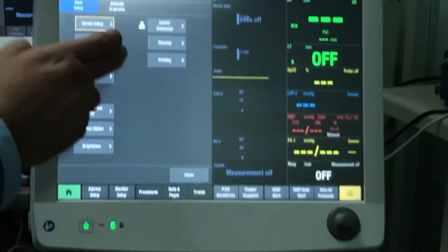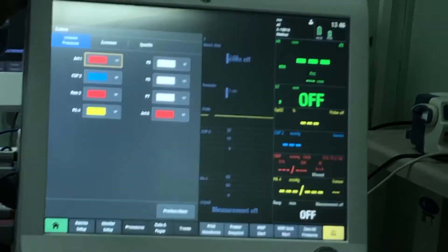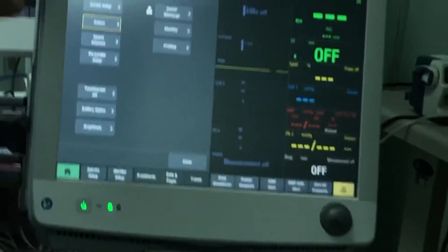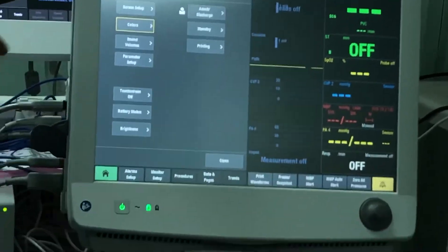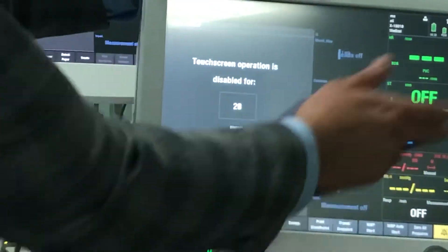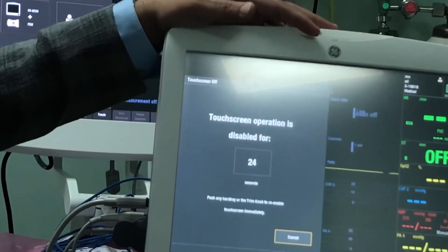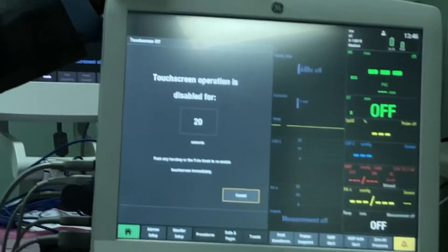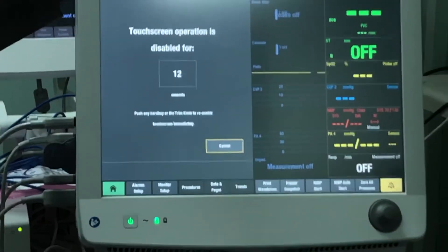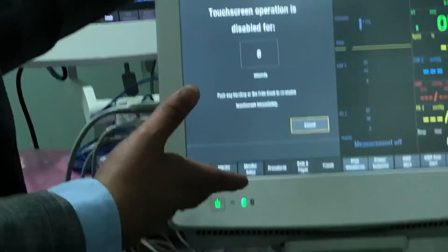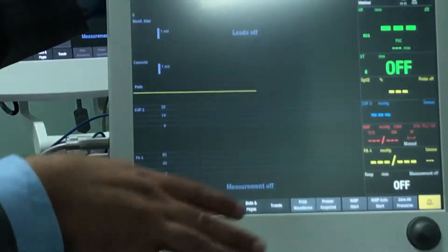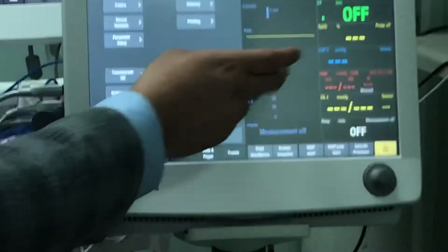You can change the colors for parameters — make SPO2 pink if you want. Just make sure if you change colors you notify others in the same department, otherwise nurses and doctors will get confused if SPO2 is yellow on one monitor and blue on another. The clean-off or touchscreen-off feature disables the touchscreen for 30 seconds so you can clean the screen, or if curious visitors or children want to play with it. To re-enable before 30 seconds, just press the trim knob and it will be operating immediately.